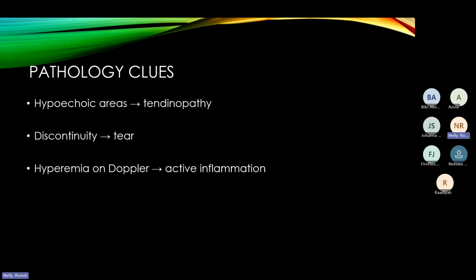is starting to the end. And remember, for tendons, it depends on where you're starting from. If, for example, you're scanning the Achilles and you're starting from the heel going up towards the muscle, then the other one now becomes like the origin. The other one becomes insertion. If you're scanning from the top, from the gastrocnemius, and you're moving to the calcaneus, then you can use origin and attachment interchangeably.